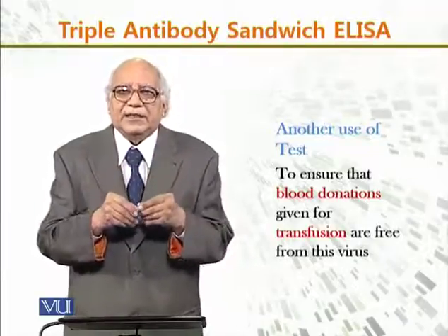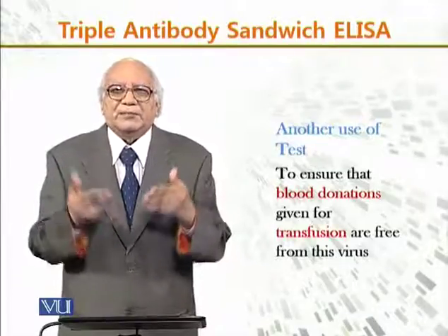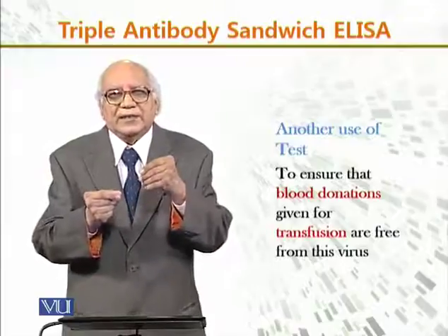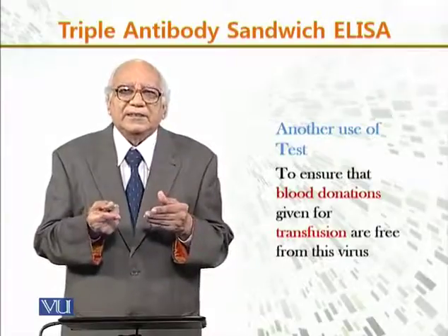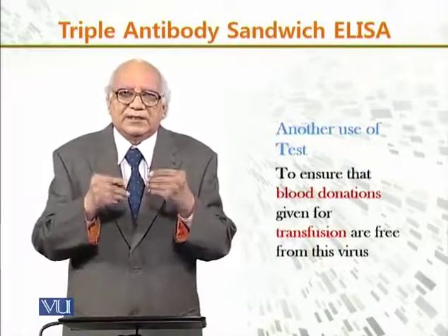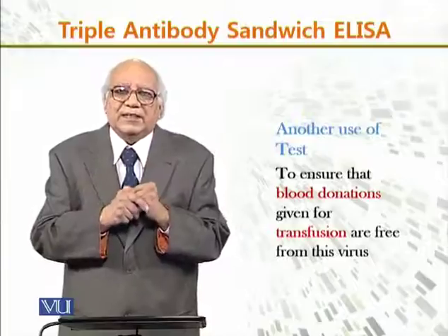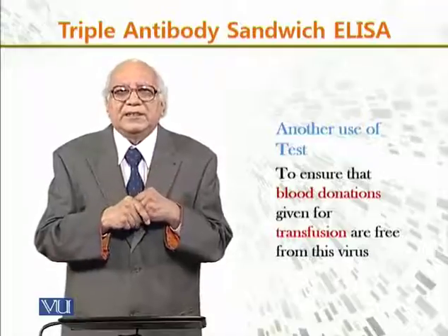Further, the marker enzymes are added, and the patient's blood serum, which does not take much time to prepare, is added, and if it gives the reaction, then we can determine whether it is HBV positive or not. And we can be sure that if it is pure and free, we can use it in the blood bank for further transfusion, which can help us a lot to make HBV-free donation.